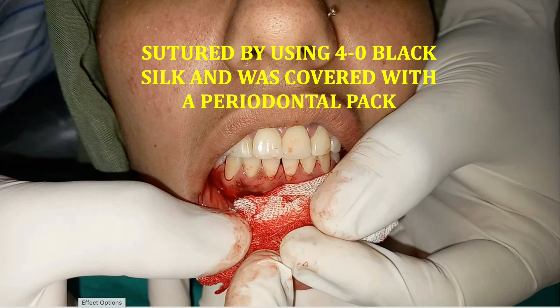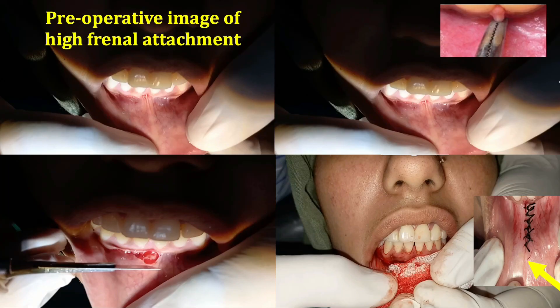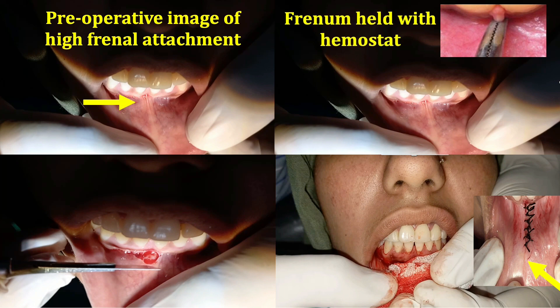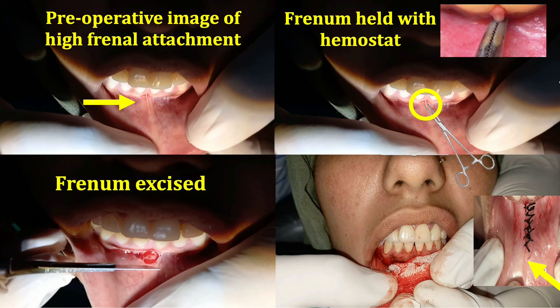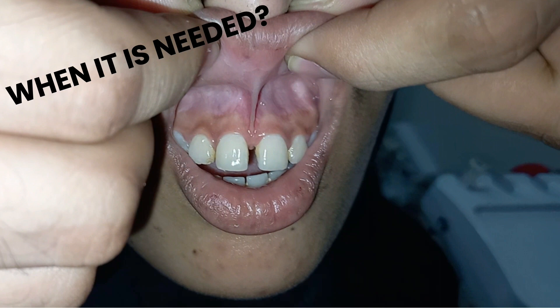The pack and suture are removed one week postoperatively. Here is an overview of the complete frenectomy. This is a pre-operative image of the high frenum attachment. We hold the frenum with the artery forceps, cut the triangular area with the scalpel blade, and after excision a diamond-shaped wound is left. We then suture that area, place the pack, and after one week we remove the suture.